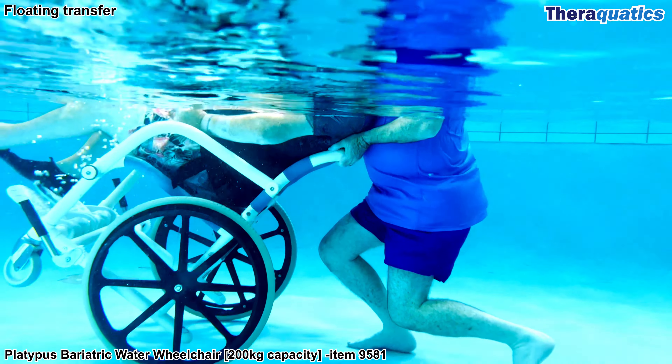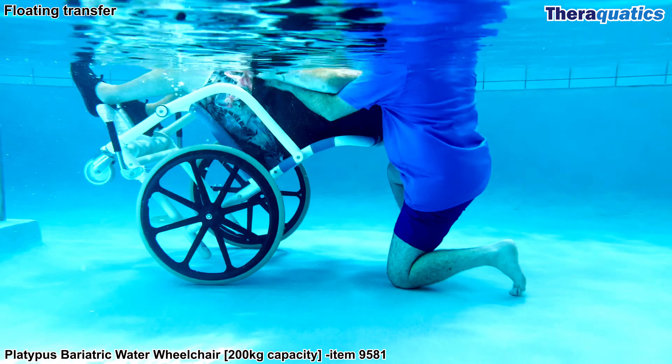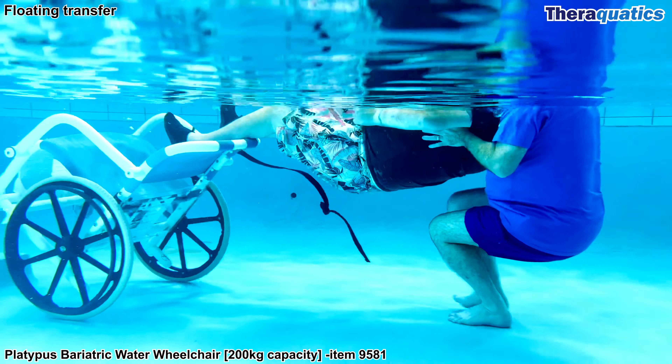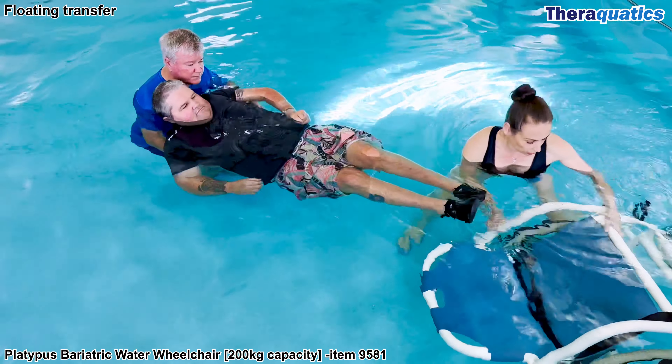In the shallow end of the pool, the support worker tilts the wheelchair backwards, resting the swimmer's head on his upper chest. He unclips the belt, floating the swimmer out of the chair while holding them under the armpits. Another support person moves the chair out of the way.